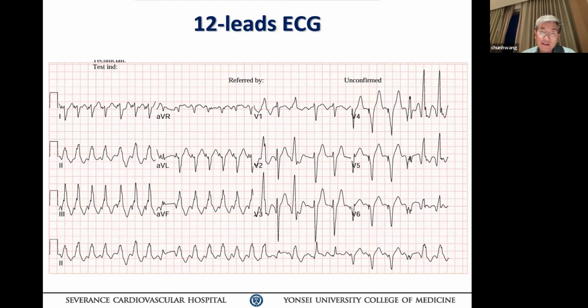Many things here are against VT. It could be atrial flutter or fibrillation with varying conduction, in view of the pacemaker sensing some of these waves and pacing, which gives you upper rate behavior of the device, which is what you see in V4, V5, okay?